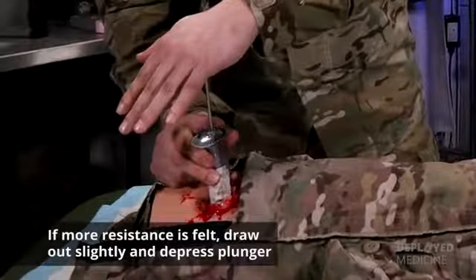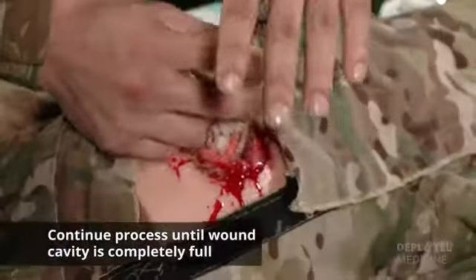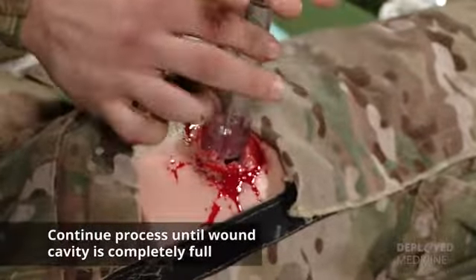If you meet more resistance, draw out slightly and depress the plunger. Do the same until the wound cavity is completely full.